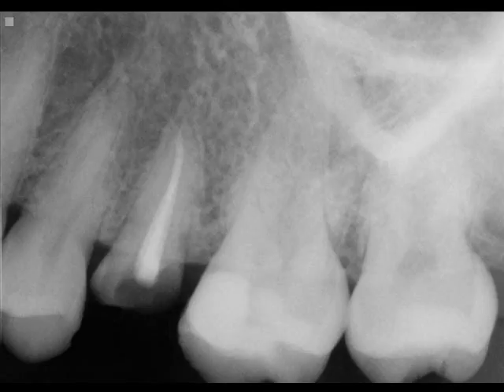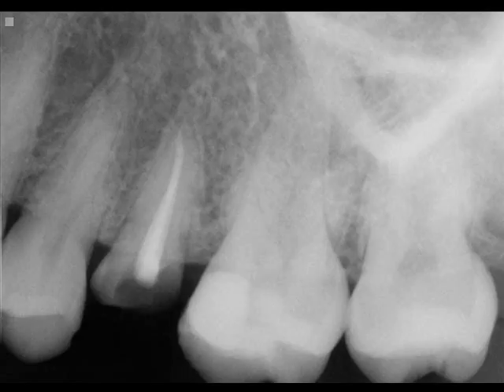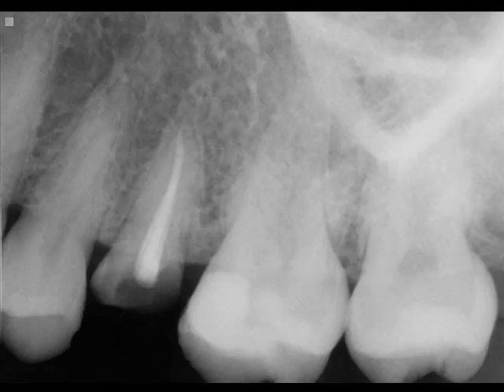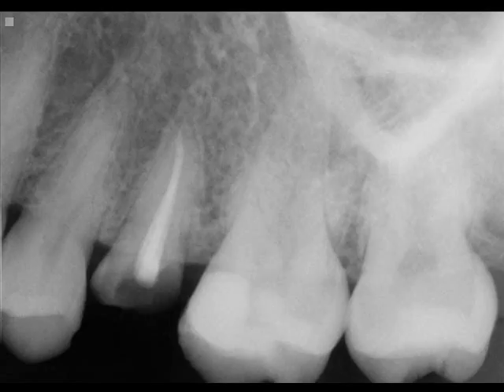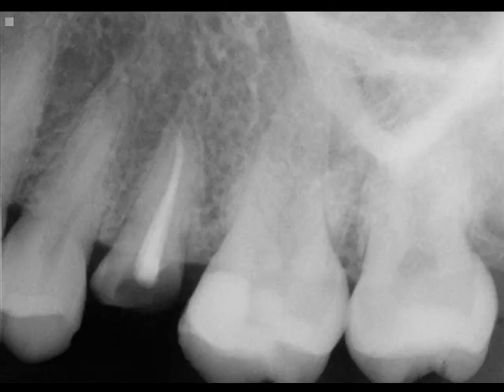This is Dr. Merzai and I'm going to be presenting an implant placement to replace a tooth that has been broken off to the gum line. As you can see from this x-ray, a big part of the tooth is missing. Traditionally, we would try and save this compromised situation by building a tooth back up and placing a crown, but there's very little tooth structure left. What's best in this situation is to actually remove the root and place an implant.